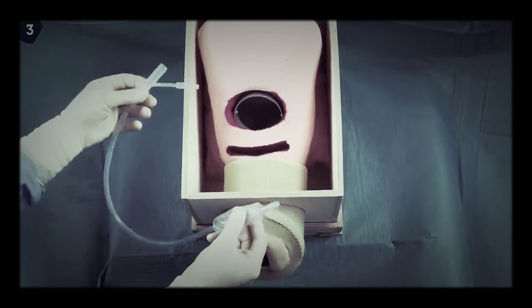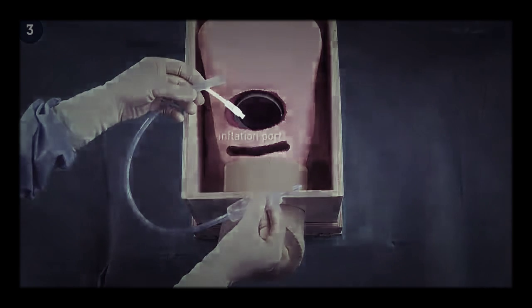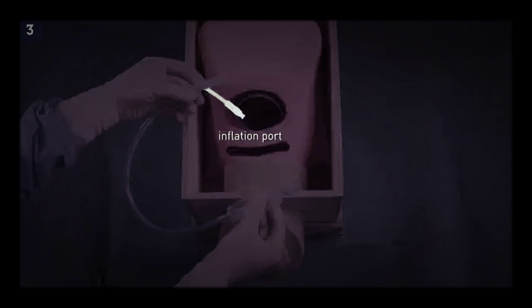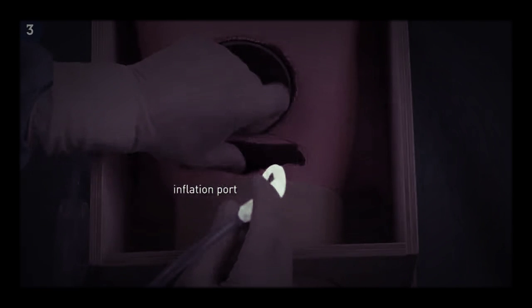If the balloon is introduced transabdominally, the inflation port and catheter drainage port are connected. Then the balloon is introduced transabdominal with the inflation port first, as seen here.